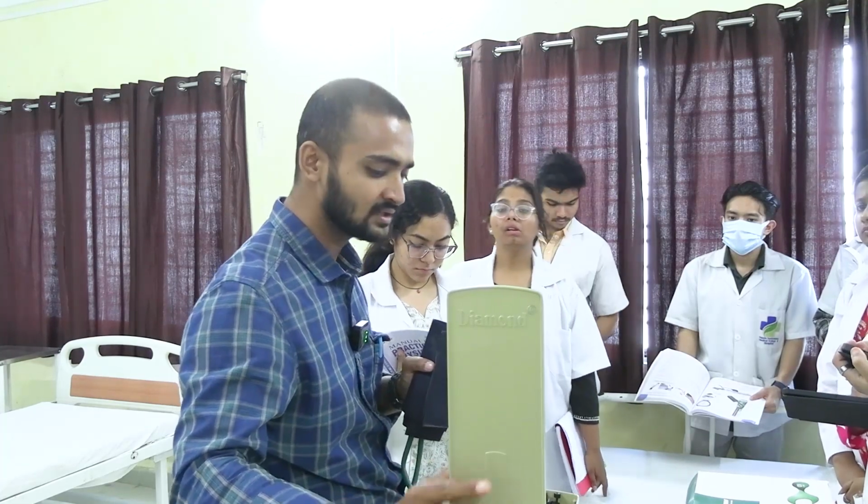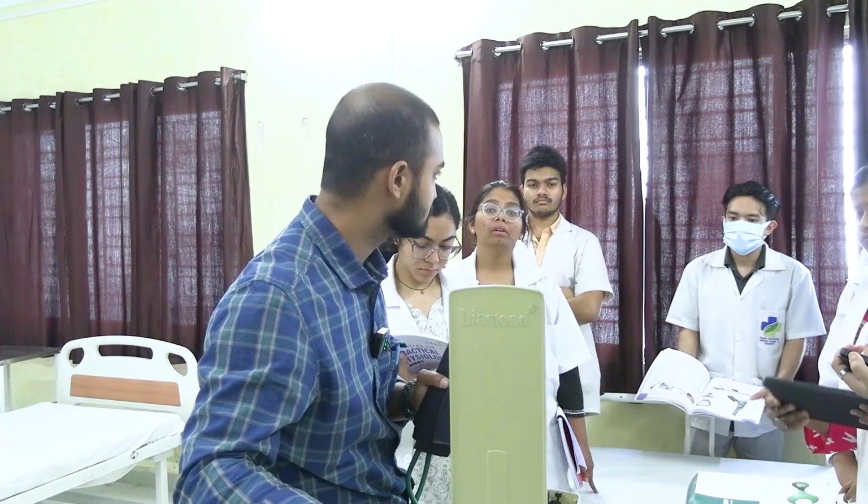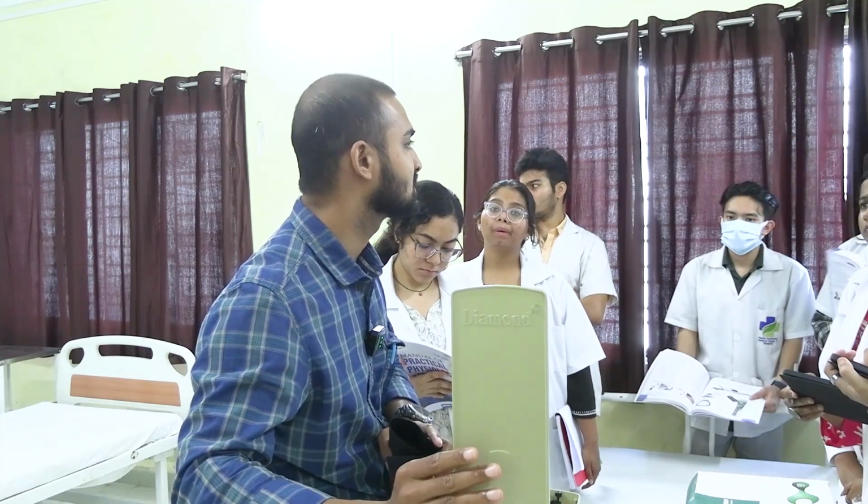Why? Because here we are taking the help of mercury. This is the gold standard because whether we go to higher altitudes or stay at sea level, the pressure doesn't change. That is why the mercury sphygmomanometer is the gold standard.